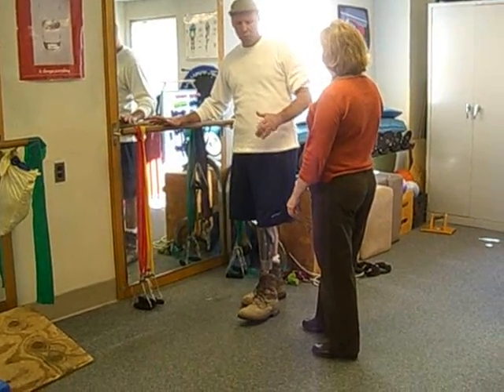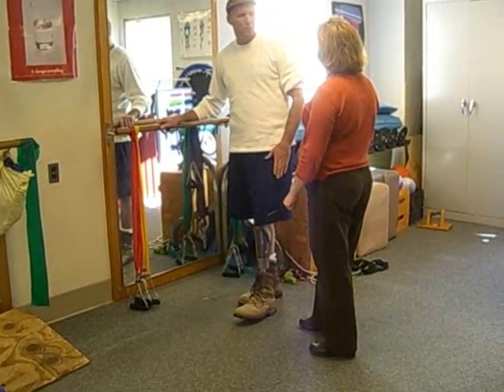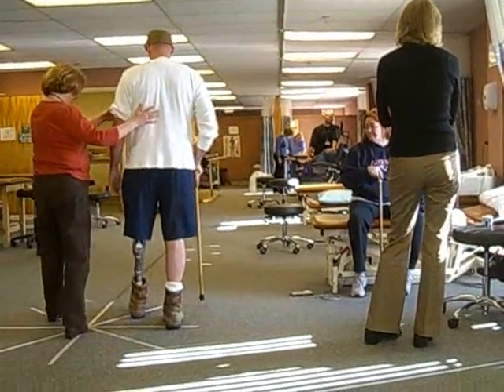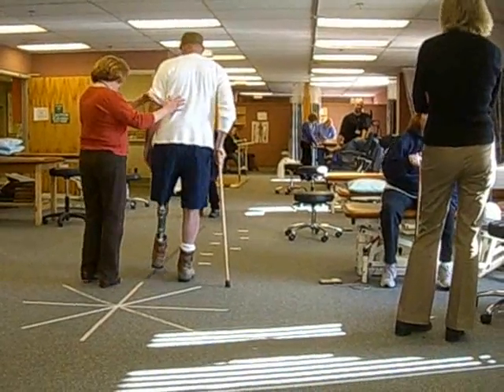Jerking forward, like going forward fast with the cane, like I'm trying to catch up to my step kind of. When you feel like you're stepping forward fast, yeah, I'm putting this foot.